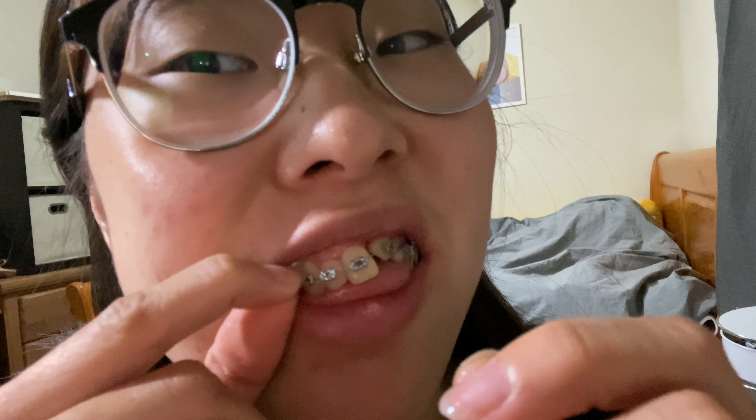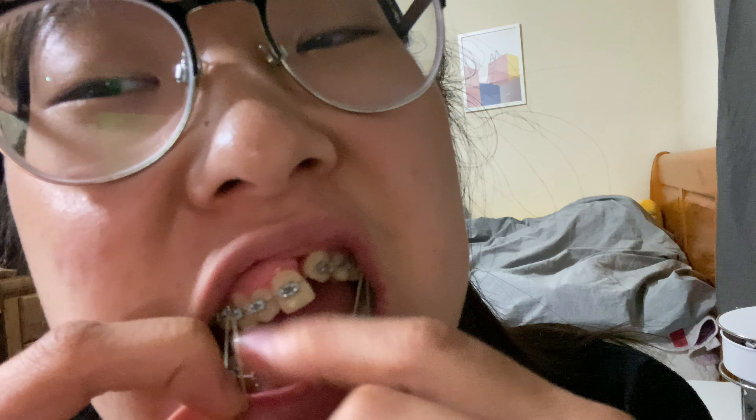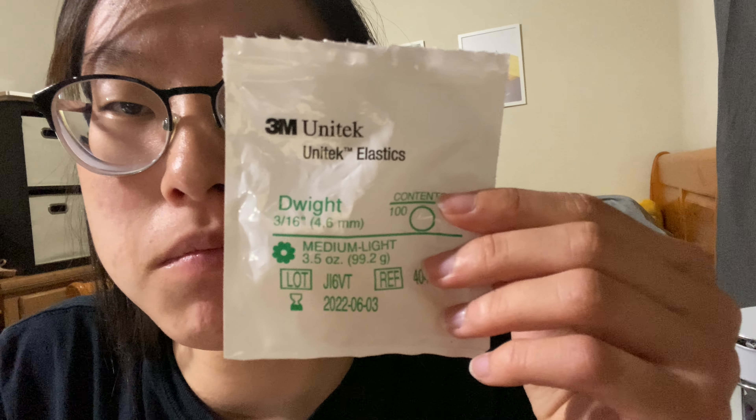You can use your fingers for this. You see the hook — and there you go, you're done with your rubber bands. This is the rubber band that I'm using right now, and it's small so it's more tight.